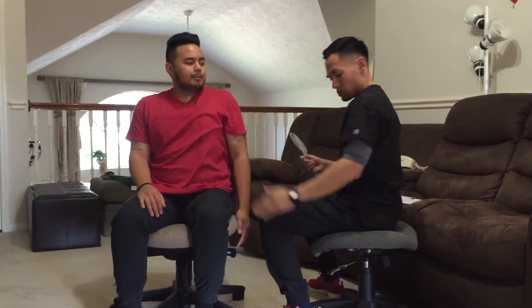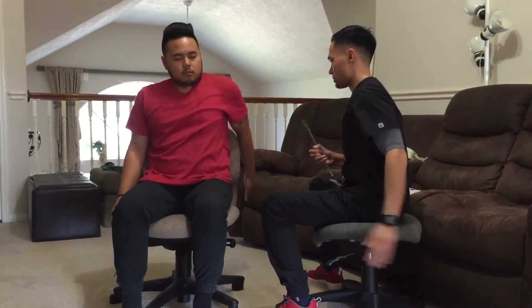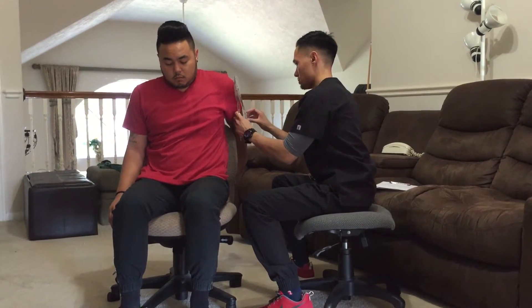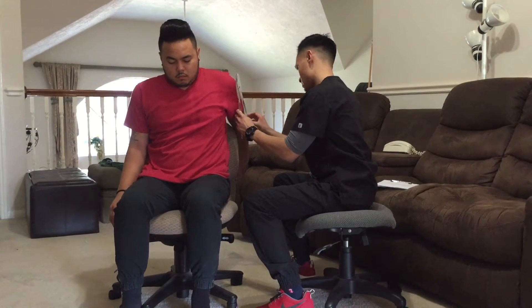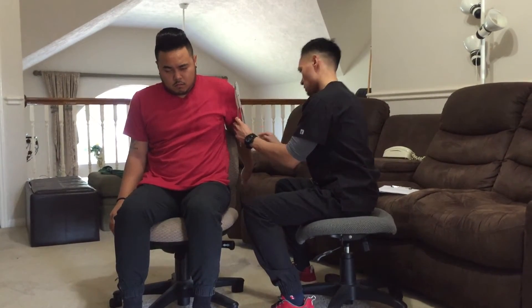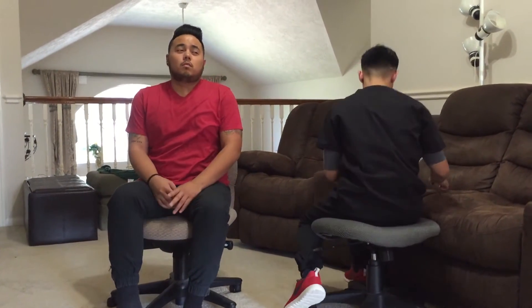Now what I want you to do is bring your palm back as far as you can go. So now we're going to take another measurement.